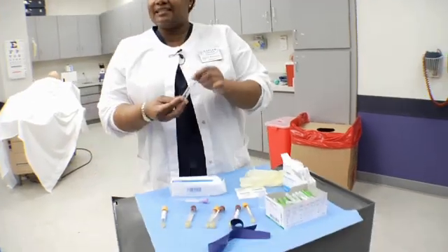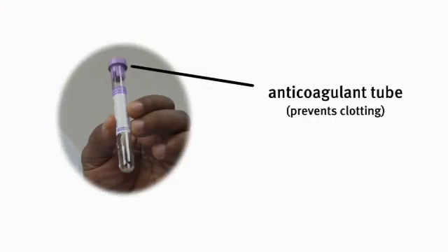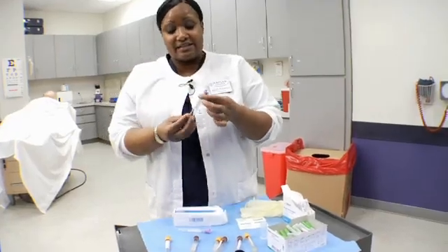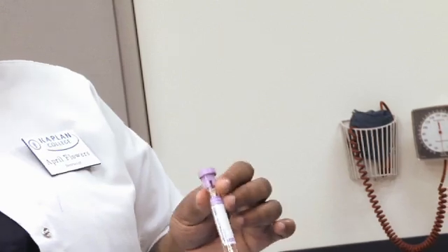Then we have our anticoagulant tube. This tube does not allow the blood to clot. It has an additive called EDTA. You get plasma from these tubes.